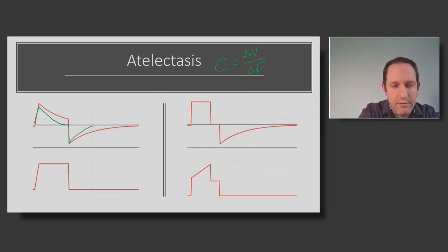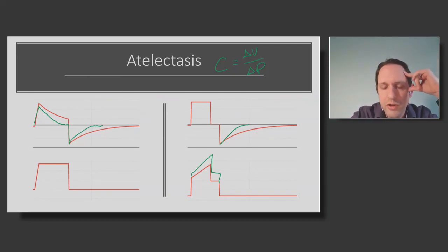And then you will exhale faster as well. That's possible. But you will also have an increase in both pressures, peak and plateau. So obviously a lot more investigation needs to happen with this. Your VTI and VTE should be the same, so you shouldn't be losing volume going in and coming out.